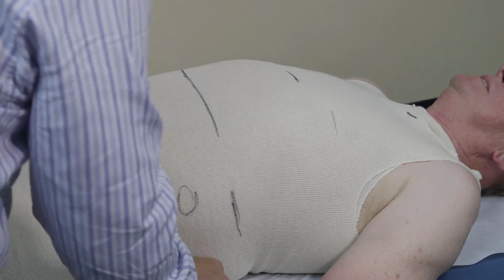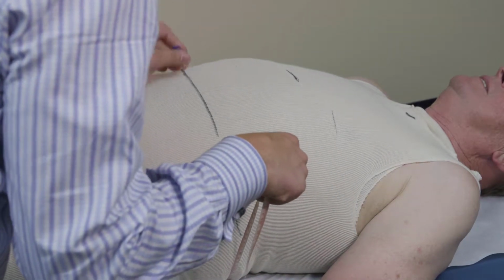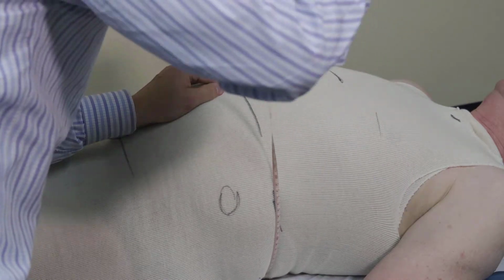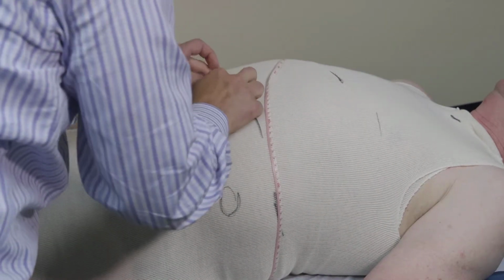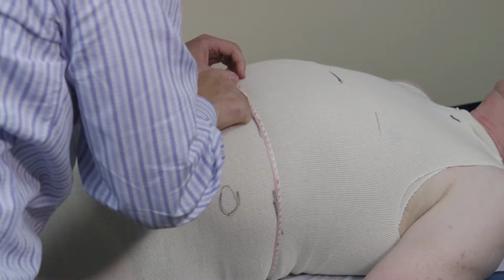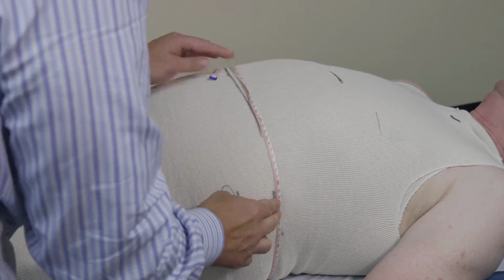Okay, our circumference for Bob is 44 1/4 at the waist.